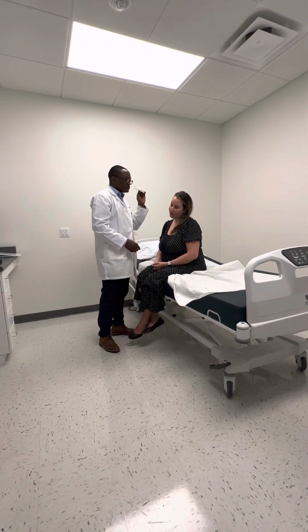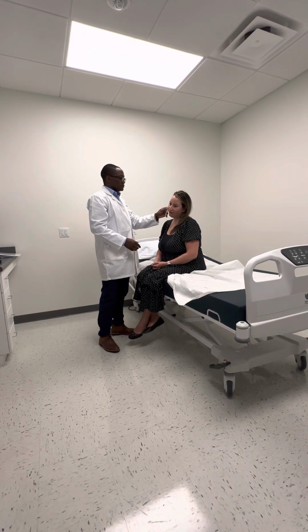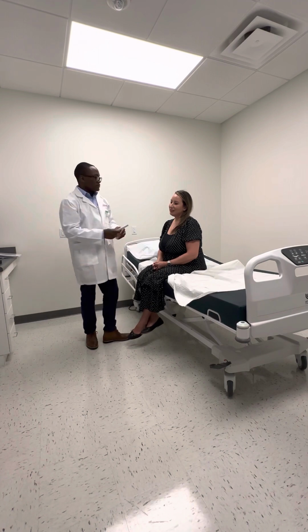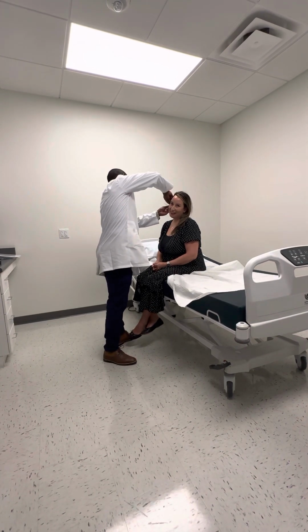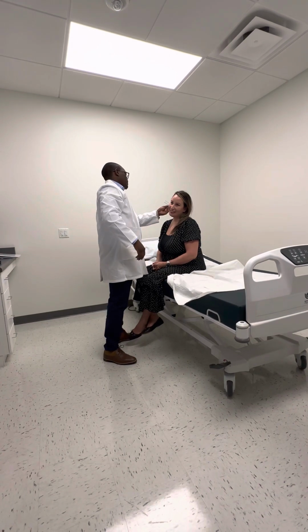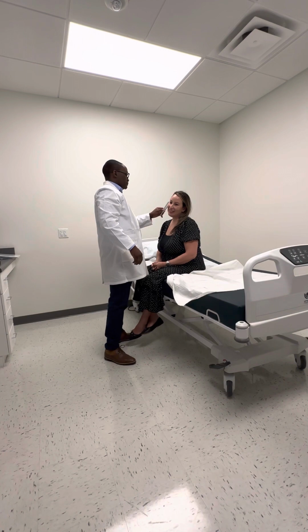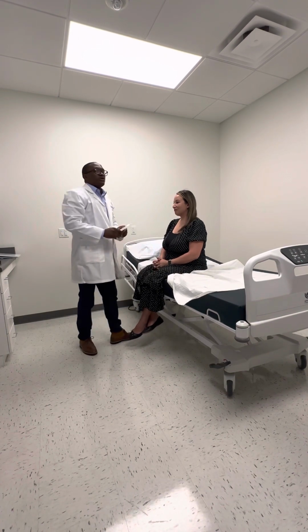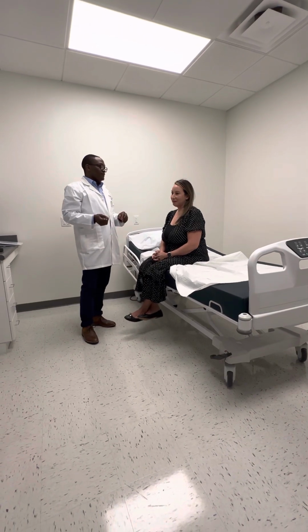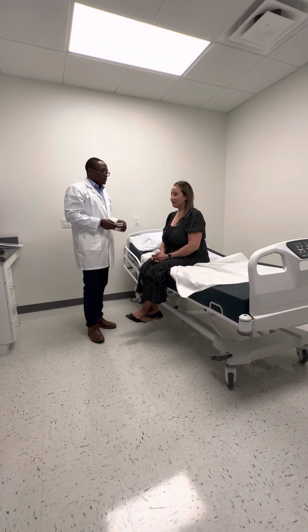There. Are you able to hear it? No. I think it's... Yes. Tell me when it stops. Yes. Are you able to hear it? Yes. So this shows that AC is greater than the BC. Air conduction is always greater than the bone conduction, okay?